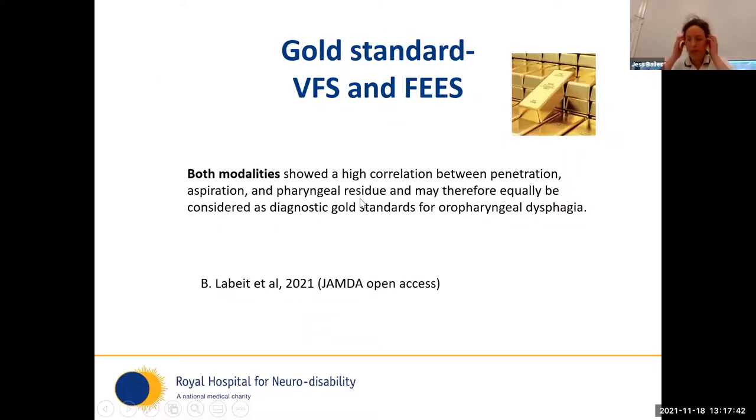So although video fluoroscopy has always initially been seen as the gold standard of dysphagia assessment, there is recognition now that FEES and VF have their advantages and disadvantages, and really they're complementary. There's a very recent study this year, an open access article, which looked at 49 patients with simultaneous FEES and video fluoroscopy, and they found that both assessments had a really high correlation between penetration, aspiration, and pharyngeal residue. So they concluded that both should equally be considered as diagnostic gold standards for dysphagia.